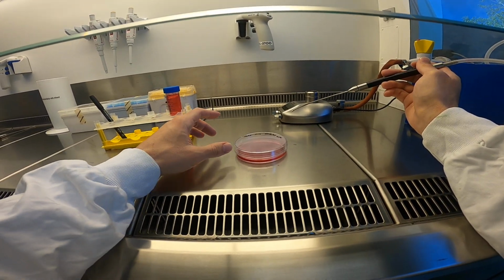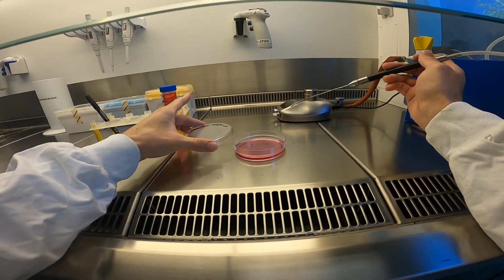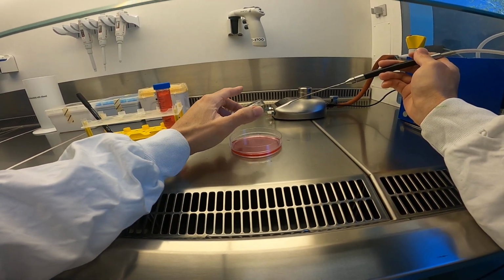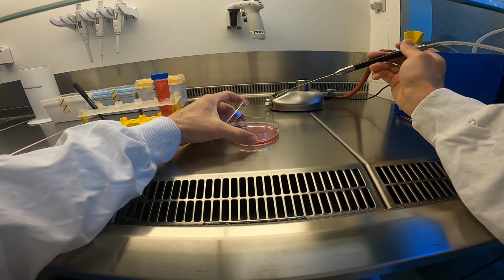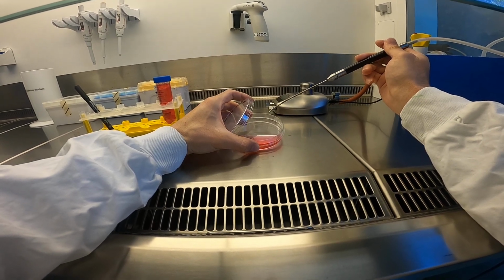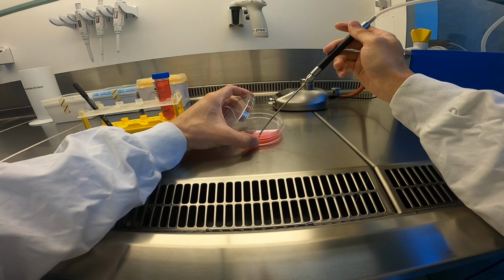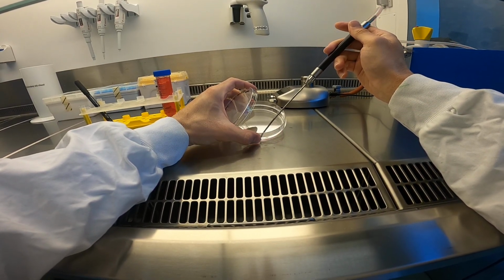Well, then we have our plate. The lid, you can put it on the side, but what I like to do to keep it a little bit more sterile is I just put it on the palm of my hand. With my fingers I grab the plate and then I tilt it 30 degrees, so all the liquid gathers at the bottom, and then slowly put the needle in there and aspirate all the liquid.